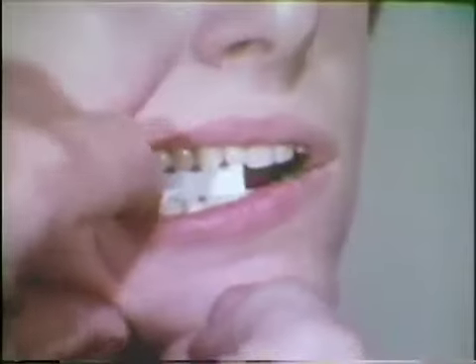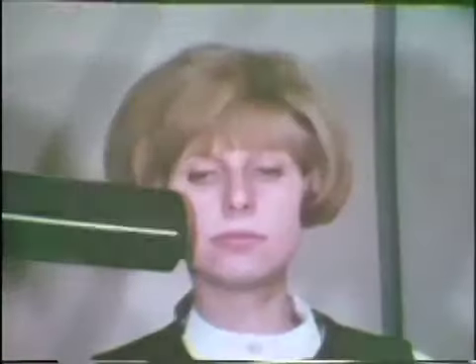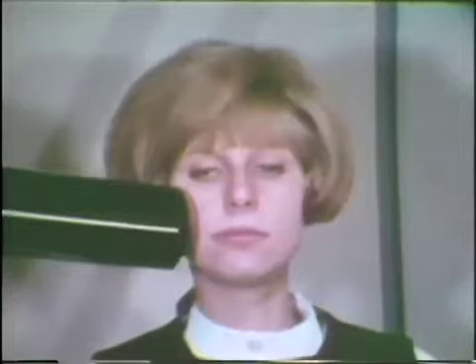With the film packet properly positioned, the previously aligned X-ray cone is lowered, or the chair and the patient are raised to a position where the center of the beam is directed at the occlusal surfaces of the teeth. Lips are closed and the exposure is quickly taken, and the film packet removed. Note that the end of the bite tab has remained parallel to the long axis of the film.